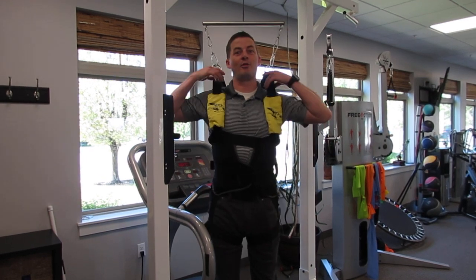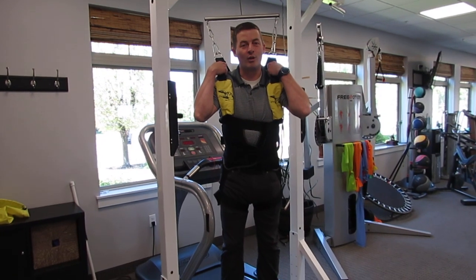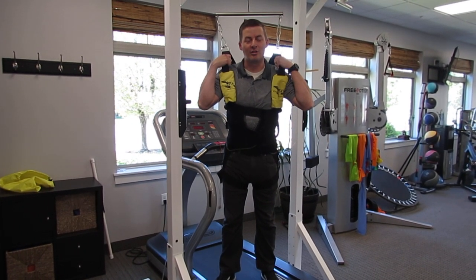I'm using one right now. This is our pneumatic unweighting system. We also have the option of doing aquatic therapy. I want to talk a little bit about the benefits of each of these and then demonstrate how this works.